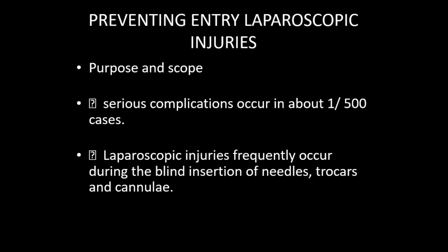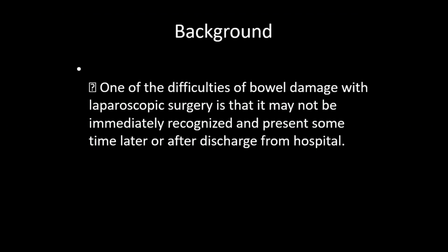So this guideline starts with the purpose and scope, then complications, and you should cover these complications, as we will discuss later, from the consent advice guidelines, and possible laparoscopic injuries that may be associated with insertion of needles or trocars, or during manipulation in different surgical procedures by laparoscopy.